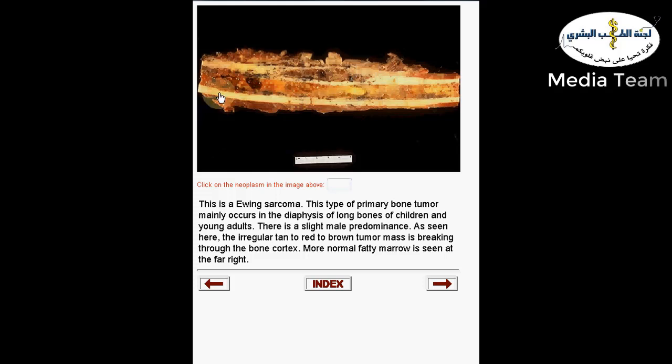Okay, so if you look, this is a part of what? This is the diaphysis of the femur, okay? If you look carefully at this diaphysis, if you were asked where is the tumor, you have to know what's normal and then to know what's the abnormal.